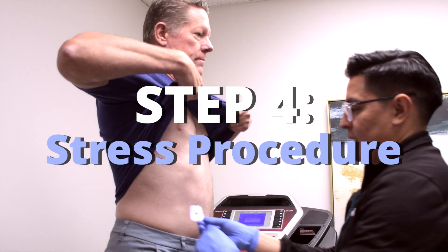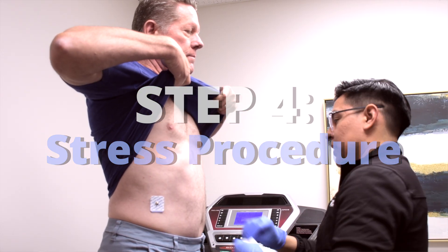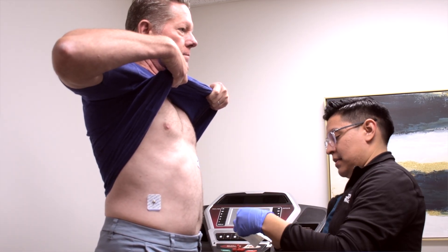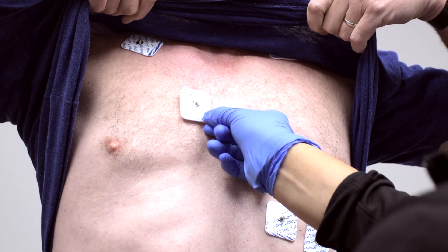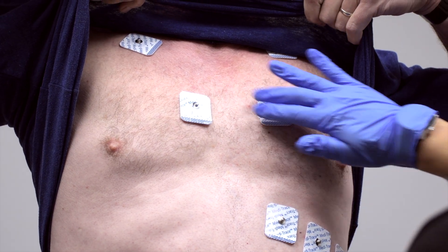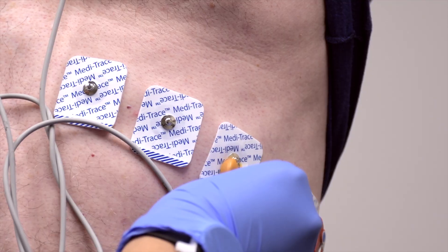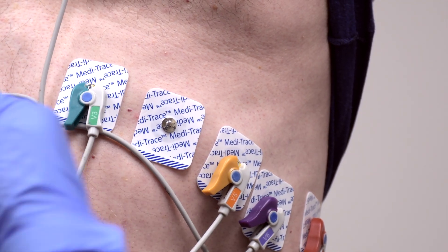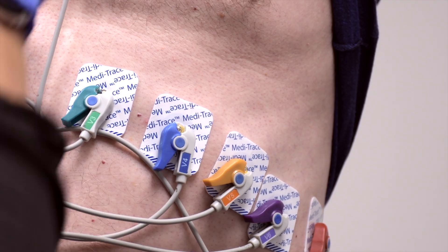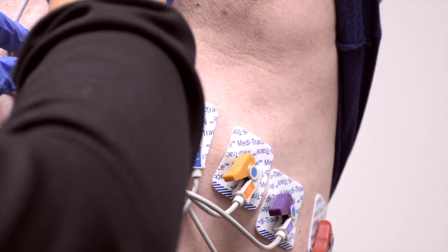The next step in the stress procedure, which takes between 15 to 20 minutes, can be administered either on the treadmill or through a chemical injection that stimulates the physical activity in the heart. Regardless of which one is recommended to the patient, both physical and chemical stress test procedures require the patient to disrobe and have 10 EKG leads placed on different areas of their chest. The EKG leads show if there are any changes during the stress test and provide the doctor with more useful information.